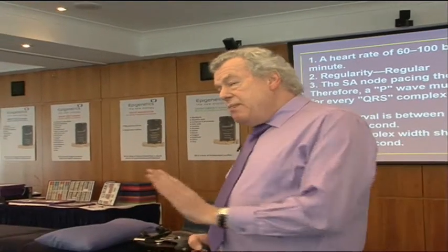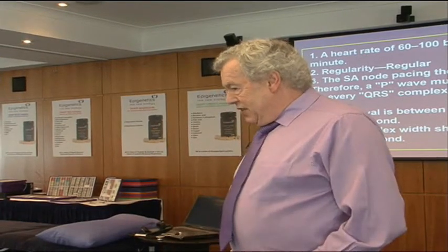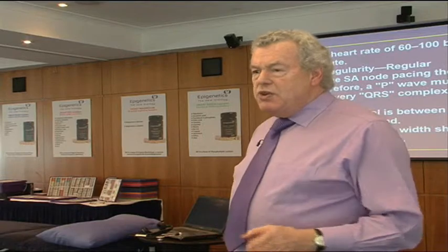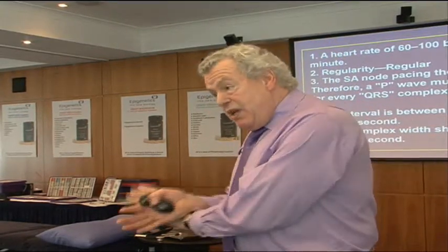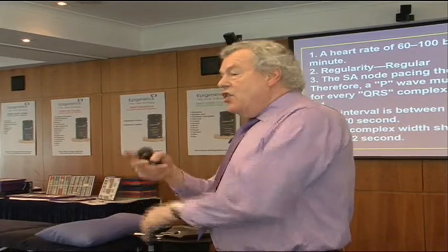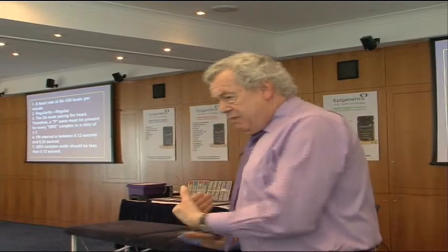But it's electrical. Okay, so the electrocardiograph really picks up electrical problems, okay, and not muscular problems. The phonocardiograph is much more important from a functional point of view of picking up functional problems, which is where we come in. We're not going to see, or be expected, people are not going to come to us who've got severe cardiac pacemaker problems.